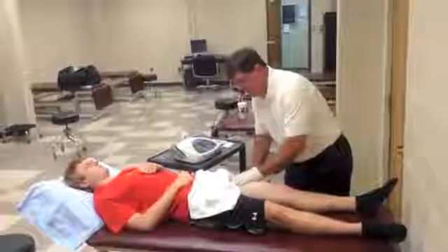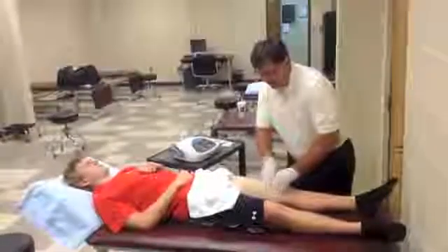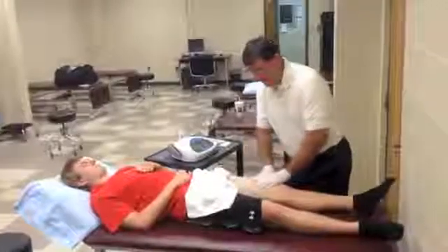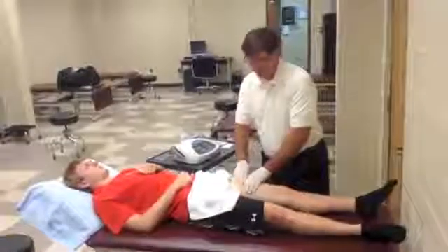It's called deep tissue oscillation. It's a combination of electrical stimulation and soft tissue mobilization techniques.